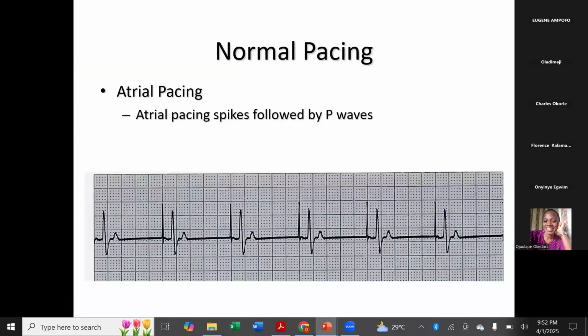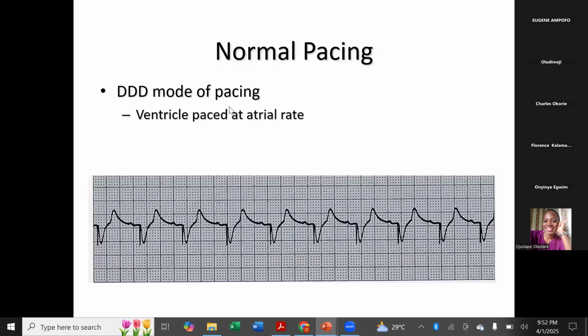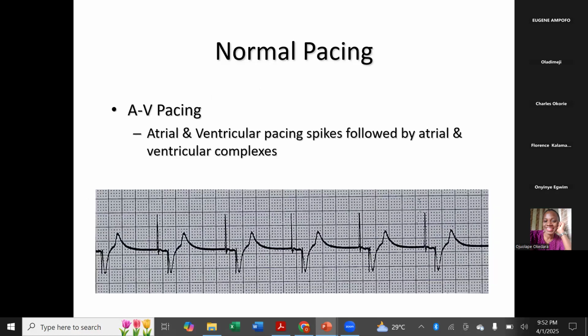So that brings us to this kind of ECG, in the sense that you will have to look very well to see the pacemaker, this tiny pacemaker spike in front of the P wave, and it's consistent. There's a tiny pacemaker spike. Sometimes it's there, sometimes it's not there. So for example, it is there in this one, this tiny dot, the pacemaker spike in front of the P wave, simply because, as we said, it's a bipolar pacemaker and the circuit is very short. But if you change it to unipolar, you will see the pacemaker spike as gigantic as this. This is like a unipolar mode, okay?